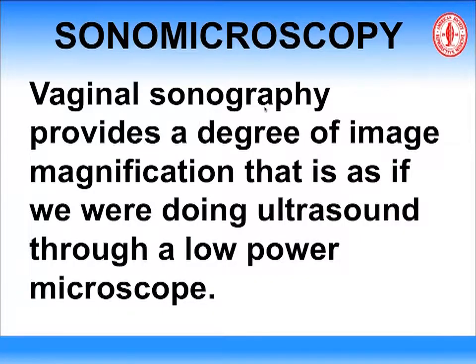In my first book, I coined the phrase sonomicroscopy because I would put forth to you that the vaginal probe gives us a degree of image magnification that is as if we're doing ultrasound through a low-power microscope.